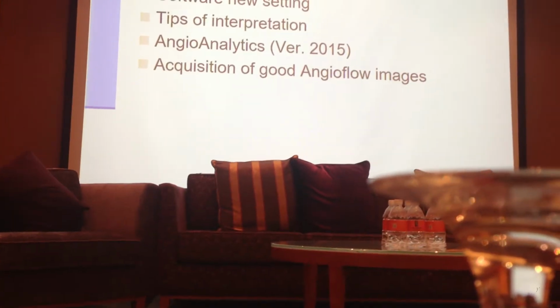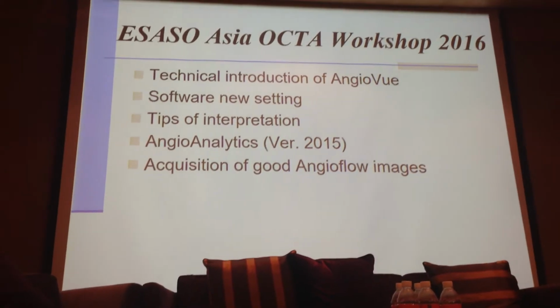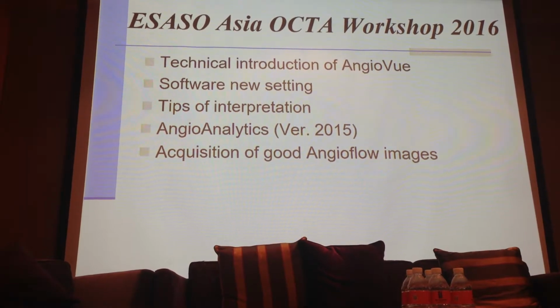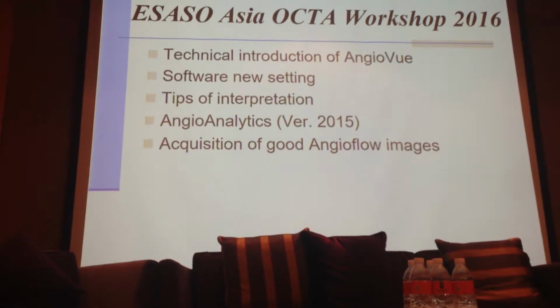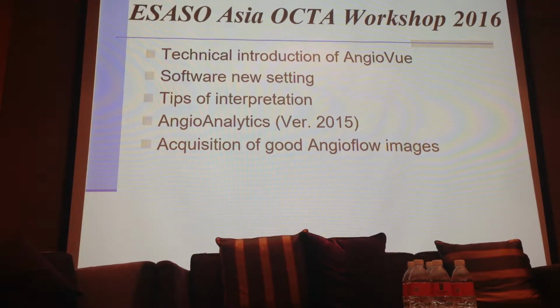Section of our report. As some of you know, we have the new software release measurement tool for angio flow. It's called Angio Analytics. And I'd like to show you how to acquire a qualified and good image with AngioView.